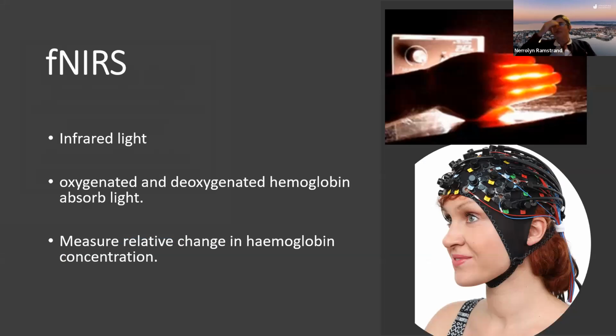There's been lots of progress in the neuroimaging area. Previously, in order to measure activity in the brain, we would have had to do an MRI or some type of imaging technique that requires the patient to remain still, which doesn't really help us when we want to measure activity in dynamic situations. But nowadays we have two options. We have EEG, which measures electrical activity in the brain, or the technique that I use, which is called functional near-infrared spectroscopy. So this is the equipment I use.